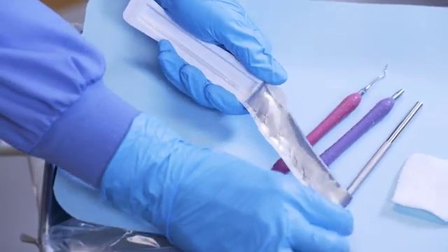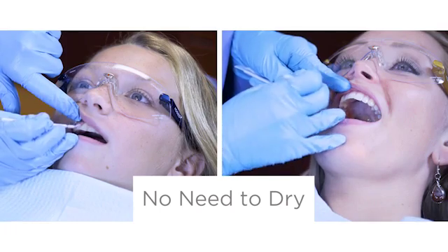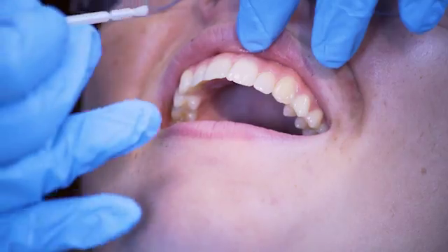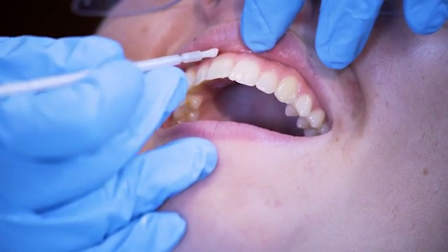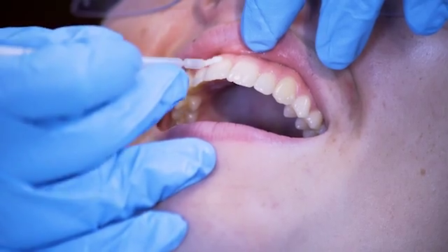Peel back the easy-to-open lid and gently stir the varnish. Nupro White Varnish can be applied directly to the patient's teeth without drying them first. Nupro White Varnish spreads smoothly, making it easier to reach hard to access interproximal areas and leaves a uniform film.